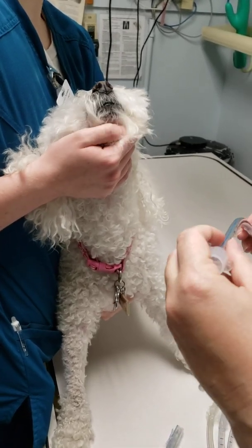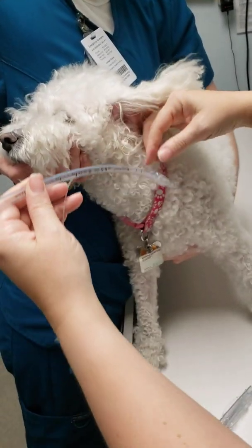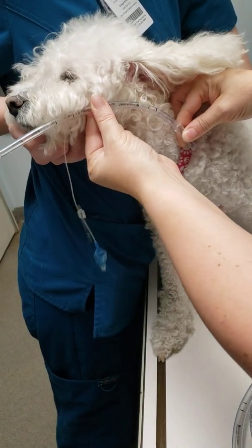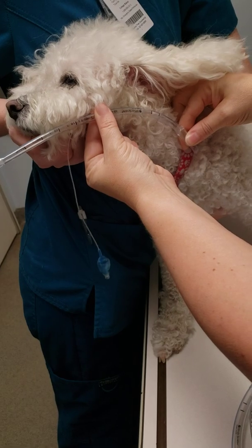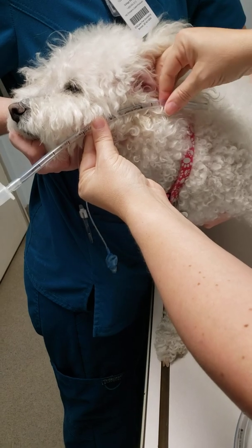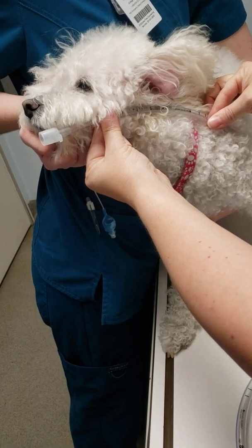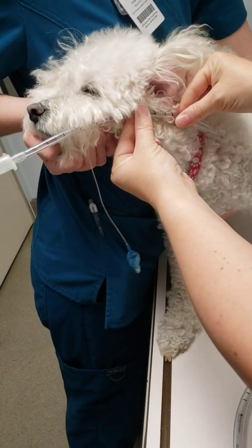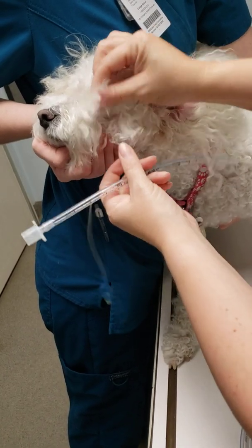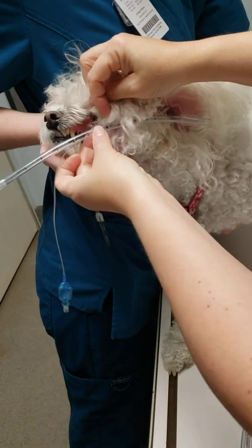The other thing you need to do is check the length of your tube, which means checking the distance from the canine tooth down to the thoracic inlet. You're going to line it up this way, and where the lips come together, that's where you're going to put your tie. Because when you tie the tube in, it cinches behind the neck and pulls it in. If you tie it too high, when you cinch it tight, you'll push the tube in too far. If you have it too low and tie it tight, it actually pulls it out. So make sure you figure out where to put the tie — at the place where the lip comes together.